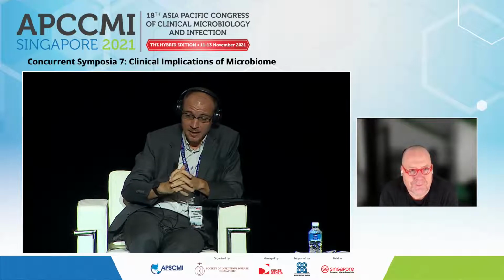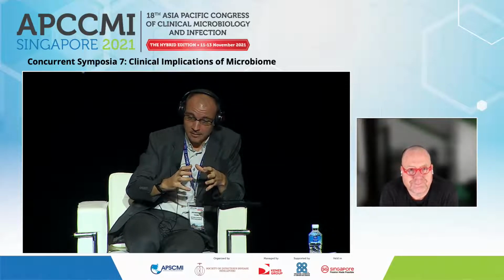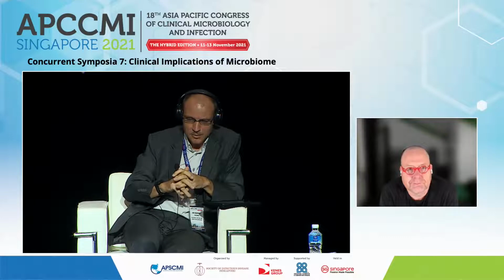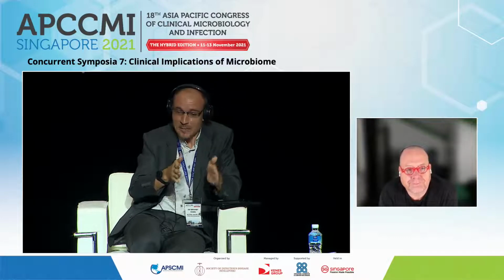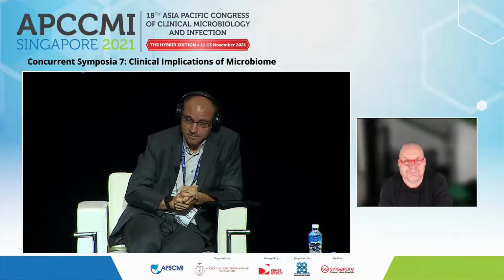I wonder if, before discussing the role of a clinical microbiologist, molecular microbiologist, or a bioinformatician, I could just ask you, we had a talk earlier on from Professor Niranjan who was talking about quasi-metagenomics for environmental microbiome samples. So collecting samples and doing some initial culturing and then sequencing it. Is that something that would make sense with clinical samples, so that you can fit somewhere in between unbiased metagenomics where you just sequence everything versus precision metagenomics? You do some preliminary culture to get good quality whole genomic samples.